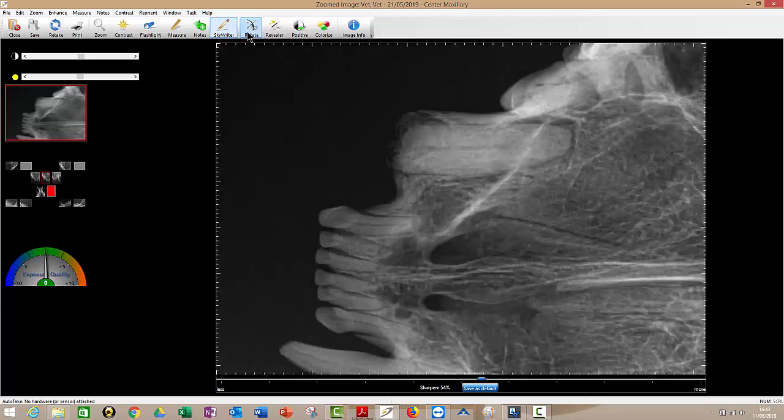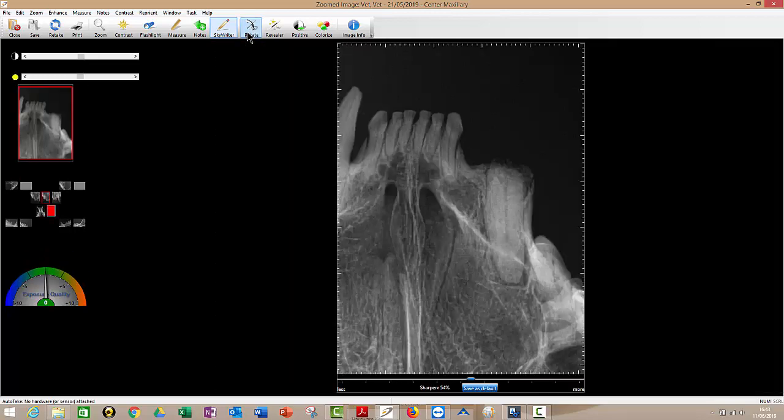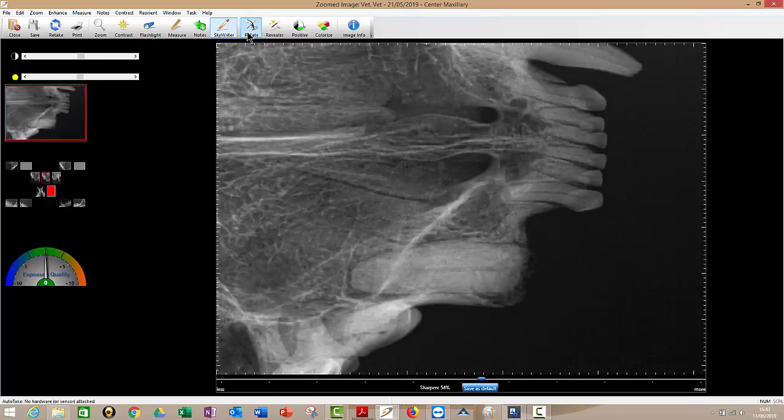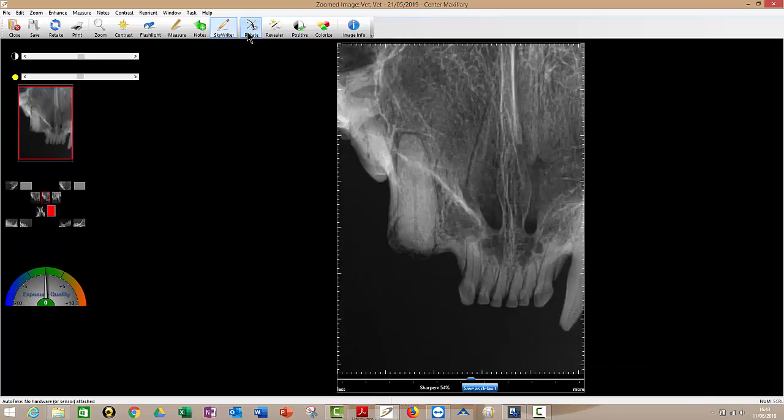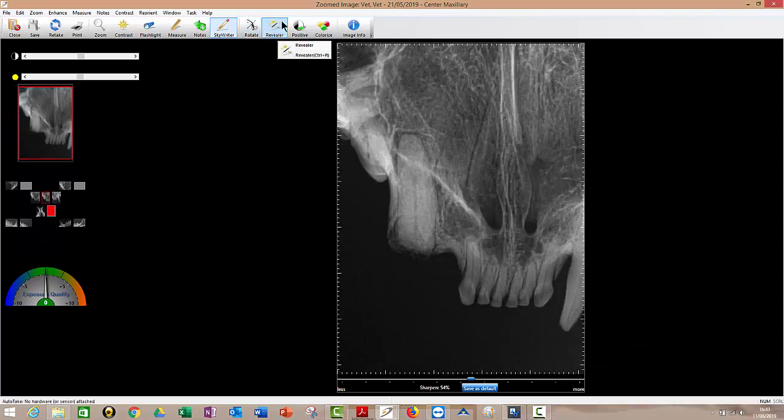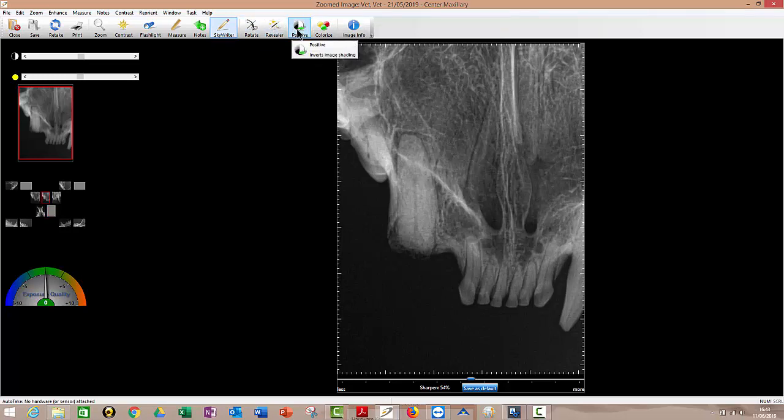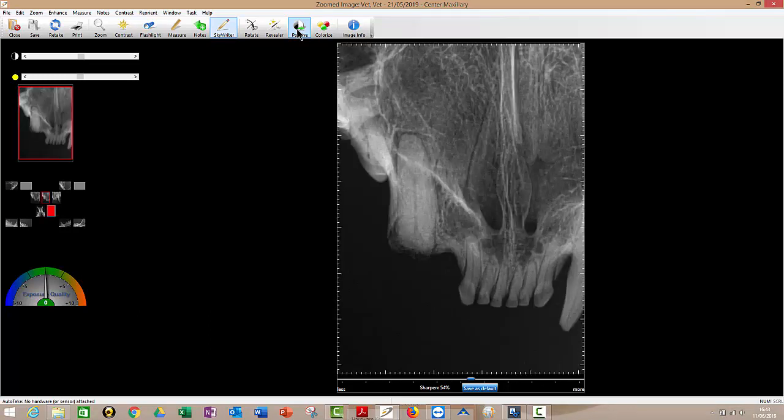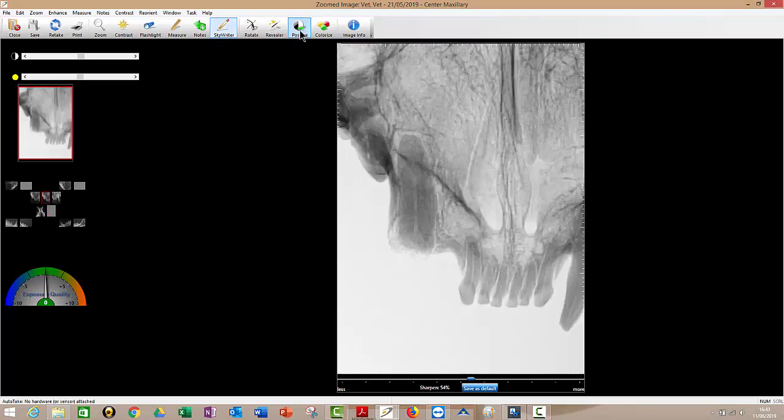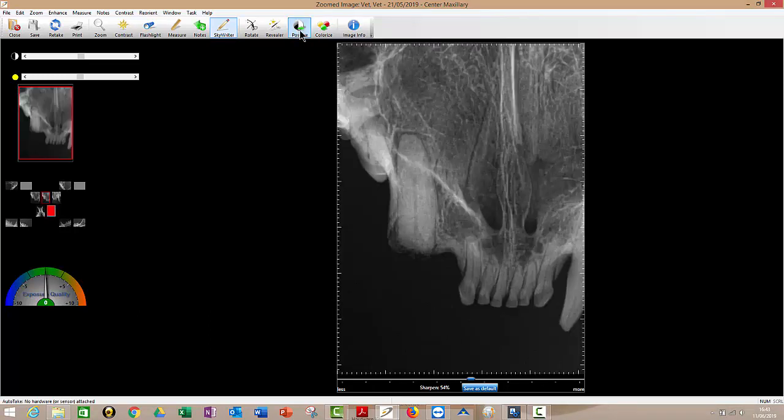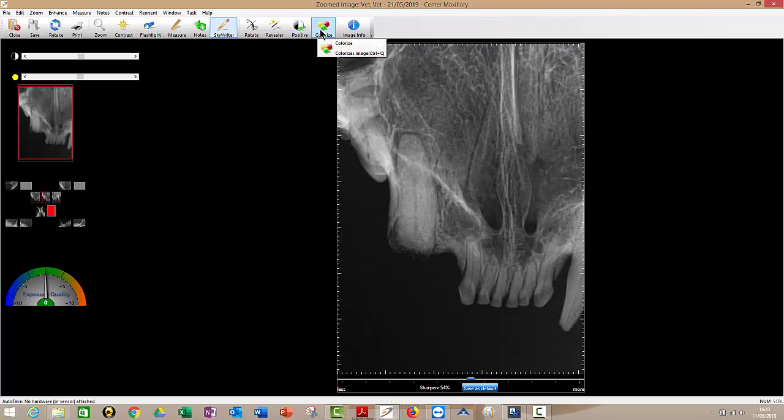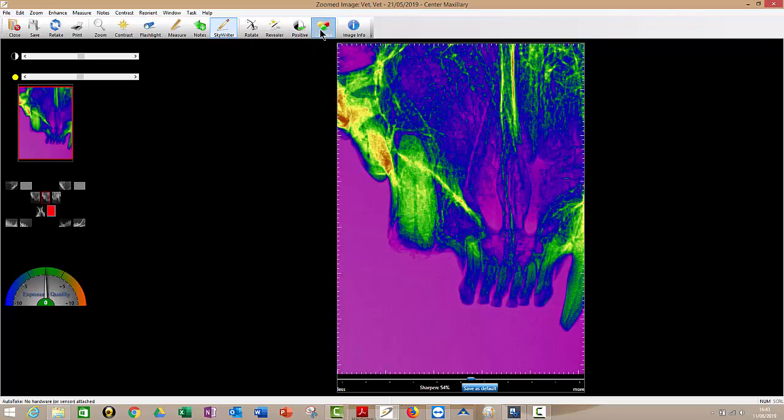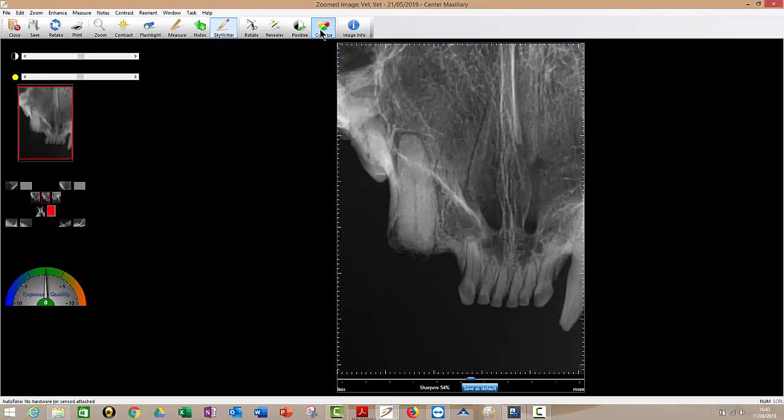Rotate, rotate four times. If I have forgotten and not selected the right box in the first place, I can rotate it so that it's right. Revealer, don't worry about that one. That's for a previous version of the sensor. It just put an extra filter over it. If I click on positive once and click on it again, you see it just turns it on and off the positive negative filter. And likewise with colorize on and off.